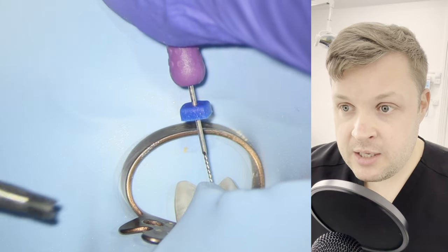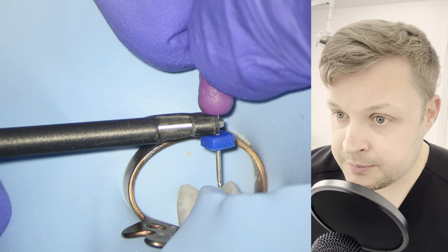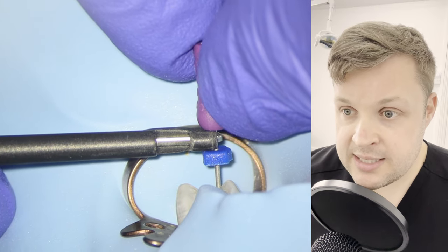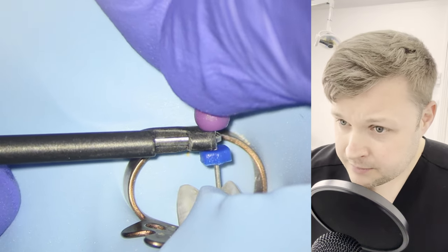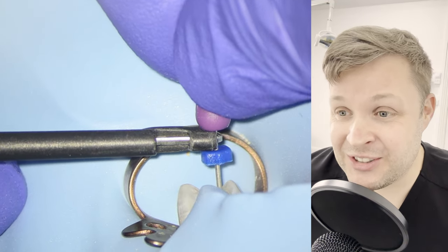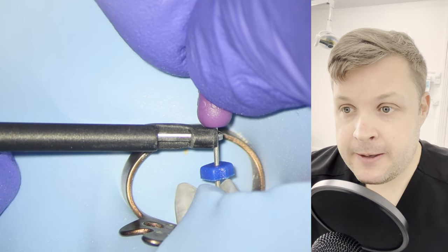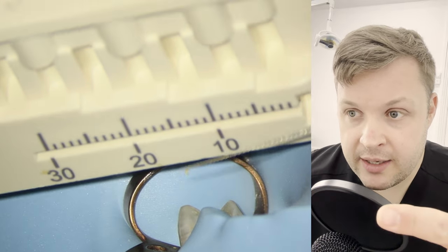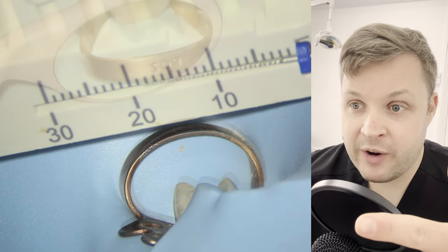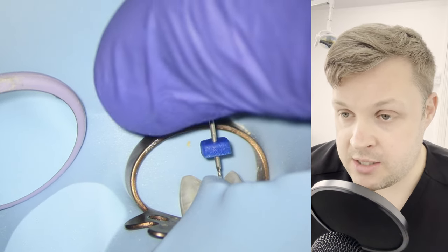The palatal canal is getting to length pretty easily. I'm going to use a size 10K file just to get to length. Actually, I tell a lie — it's not getting there really easily at all. And again, this is ringing alarm bells in my head, thinking: do these canals join? Because usually when it's difficult to get to length, it means the join somewhere is difficult for your hand file to reach around that anatomical anomaly.